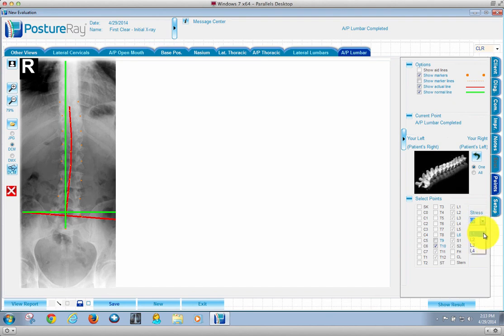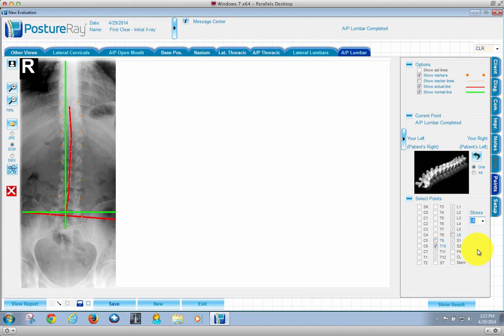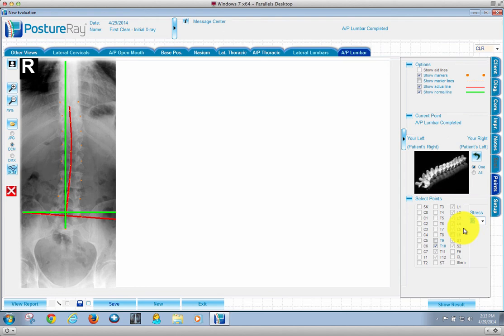So remember in AP views, you always have this stress vertebra. Watch, I'm going to change it to L4. Notice how it changed the red line. Let me go back to L2. That does the best fit for that analysis.